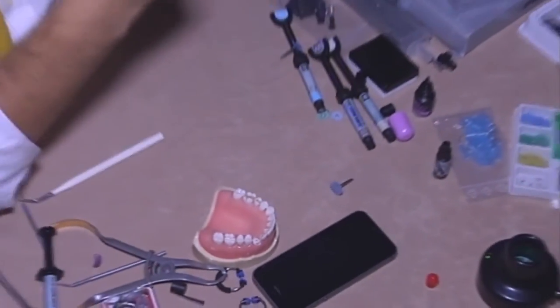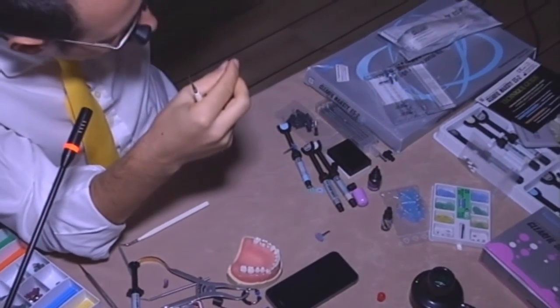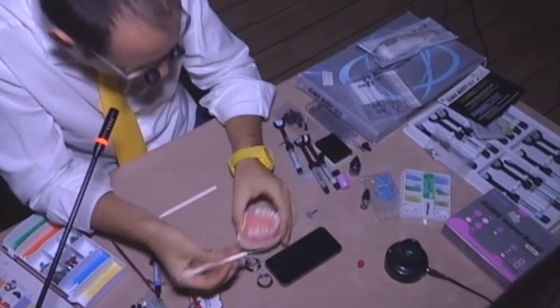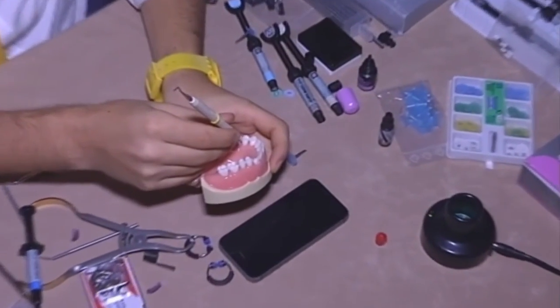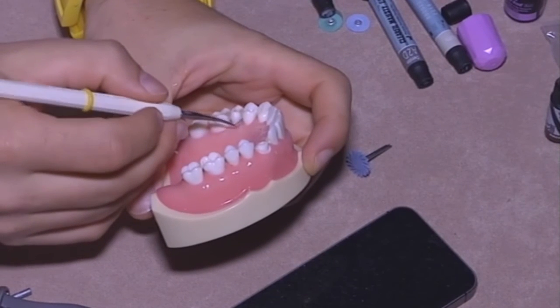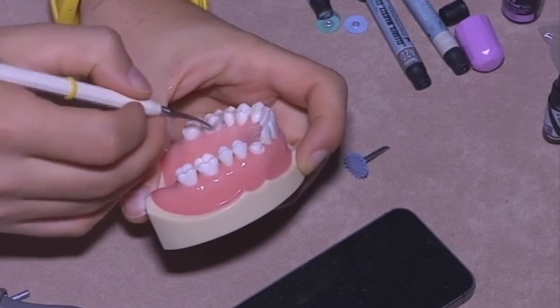So my assistant, she knows, and she cuts them in two. So I have thinner interproximal strips that can pass easily down the proximal contact in order to remove eventual excess of composite here and here.